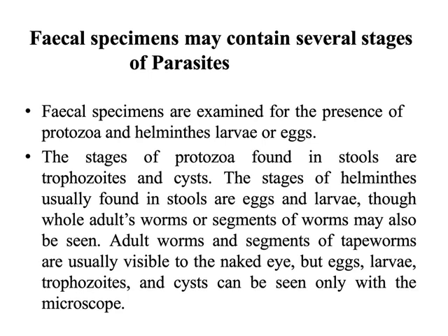So the fecal specimens may contain several stages of parasites. First of all, the fecal specimens are examined for the presence of protozoa and helminth larvae or eggs.